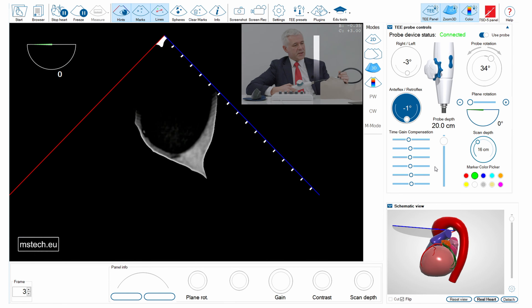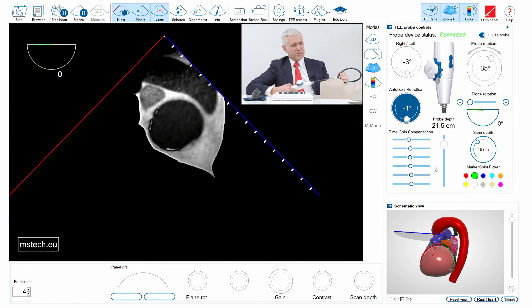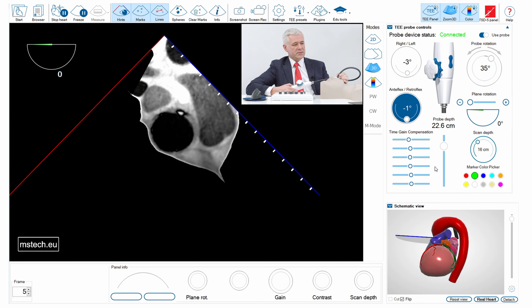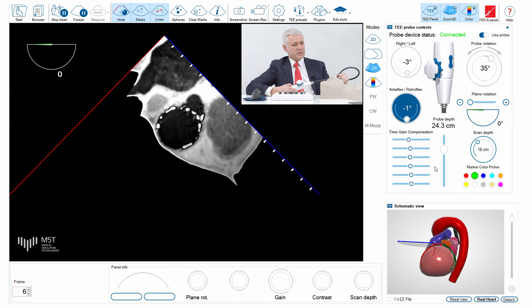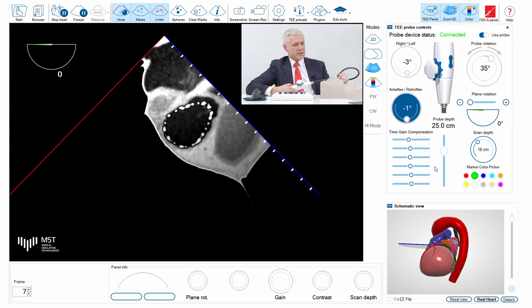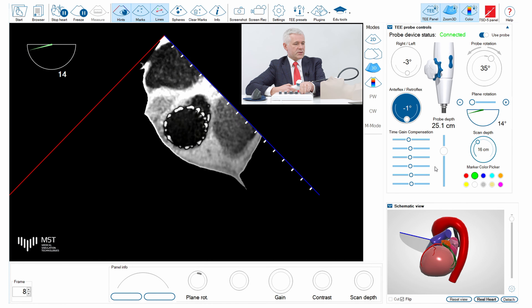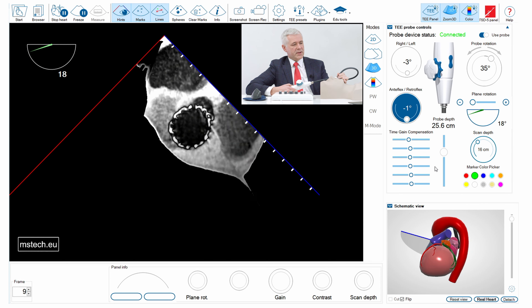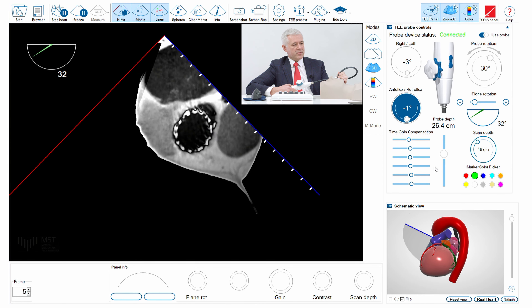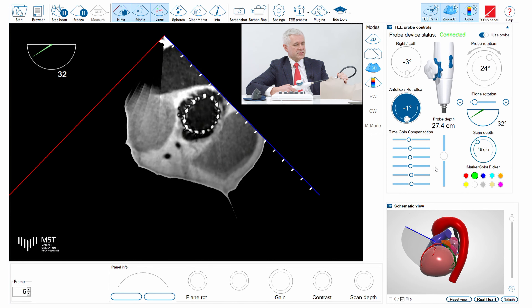I'm inserting the probe in zero degree view, going from the upper part of the esophagus down, and you can see the bright echoes corresponding to the stent of the TAVI valve. As soon as I get closer to the aortic valve itself, I have to change the angle of the plane to approximately 30 degrees to keep it in short axis view.